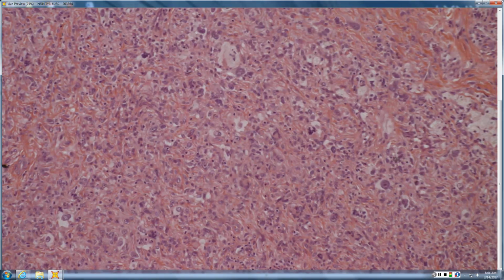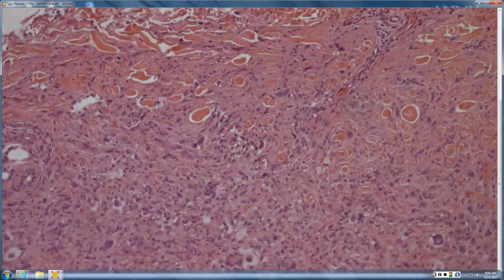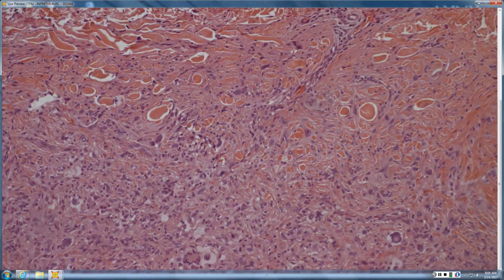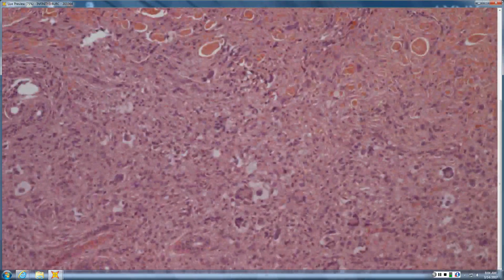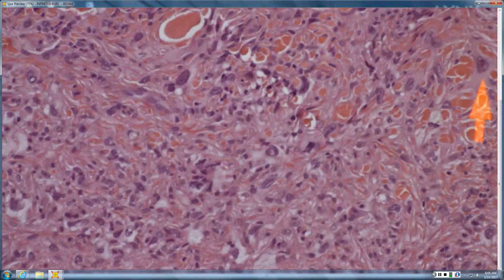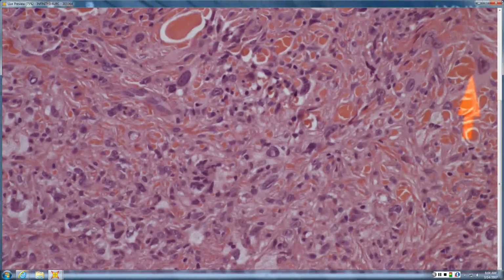So if it's a more fibrous tumor, dermatofibromas, and so you start asking, could this be a DF? Well, I see lots of Touton giant cells, which DFs and xanthogranulomas have. There's certainly lots of collagen balls at the periphery. So I'm going to look for things like overlying acanthosis. What about these big, monstrous nuclei? Are there any sort of dermatofibromas that have big monster cells? Yeah, dermatofibroma with monster cells.